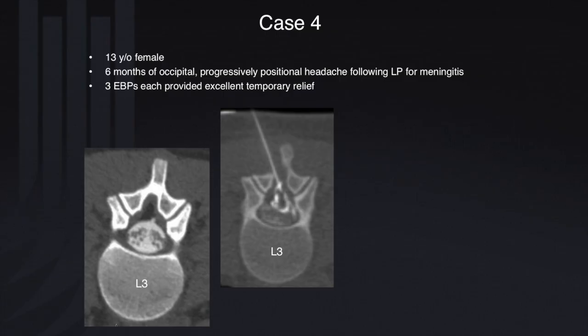I will say I've had many, many patients where you'll do a patch for one of these types of situations, and you'll get incremental progress with each patch. So they'll report, oh, I'm 25% better from baseline. Now I'm 50% better from baseline. Now I'm 70% better from baseline. So I've had a few patients where we've had to do 4 to 5 patches to get them to a point where they're 90+% better and can go about living their lives again.